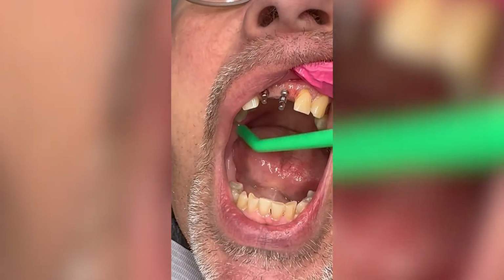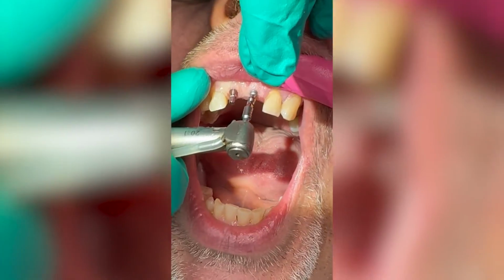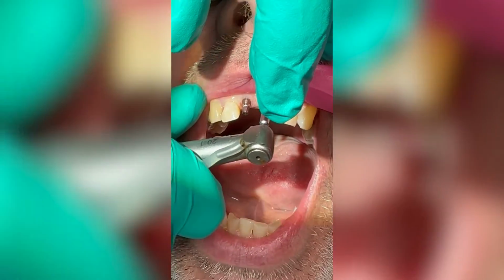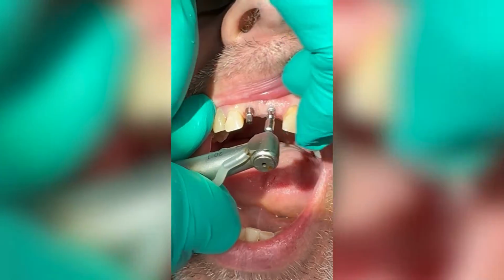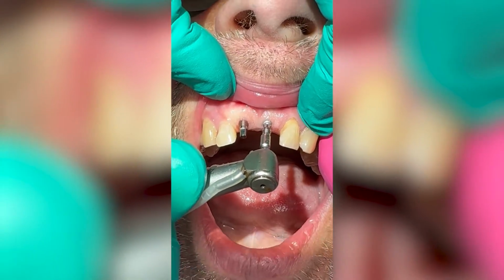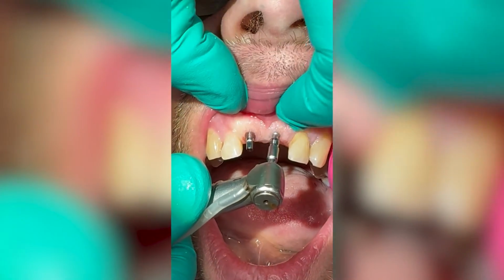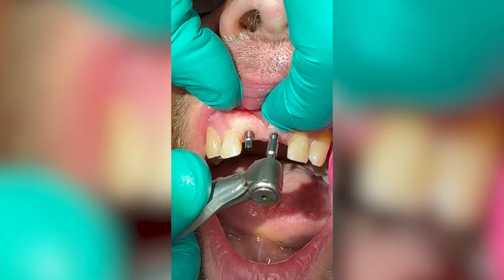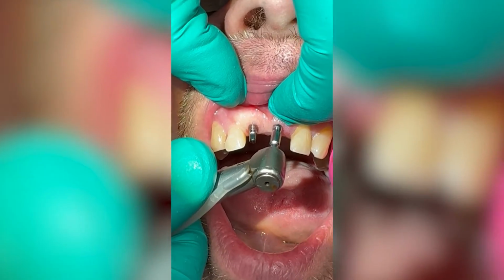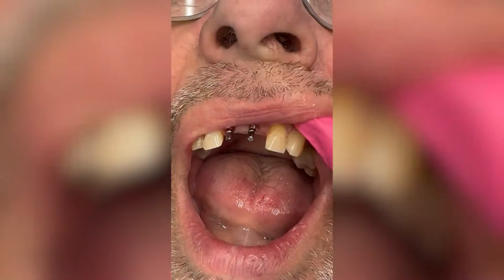Okay. Now we're going to go ahead and place that implant with the motor to measure the torque. And we're getting 30 Newton centimeters of torque, and it already stopped the motor at that point. So now we're going to go up to the 60 and place it the rest of the way. And we almost have that all the way in.